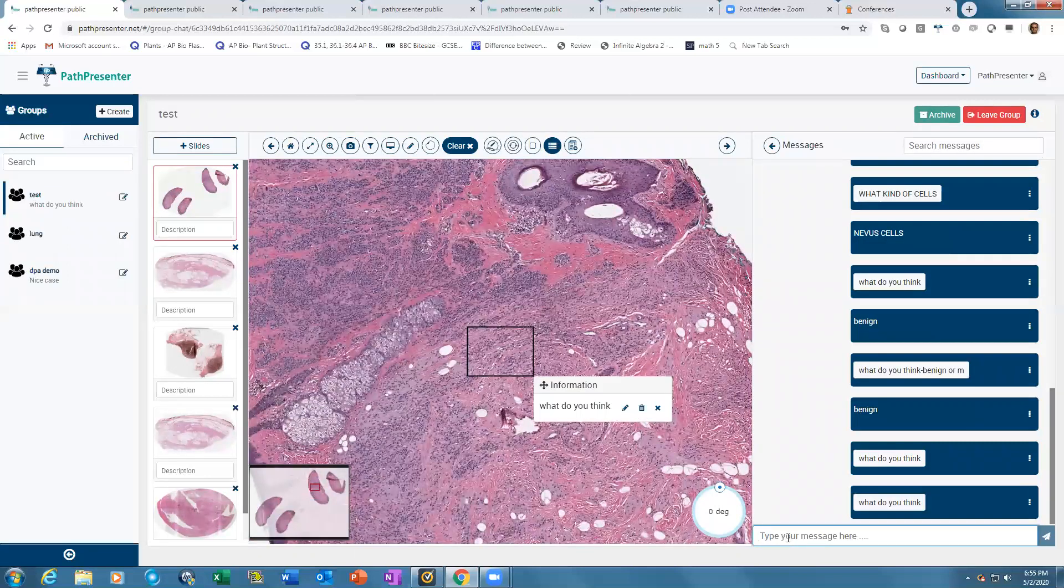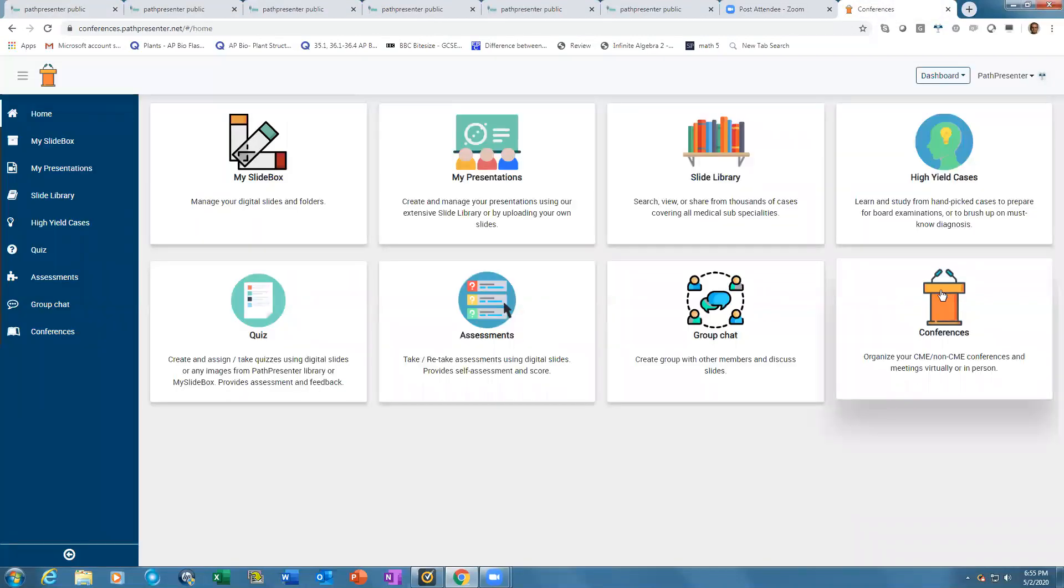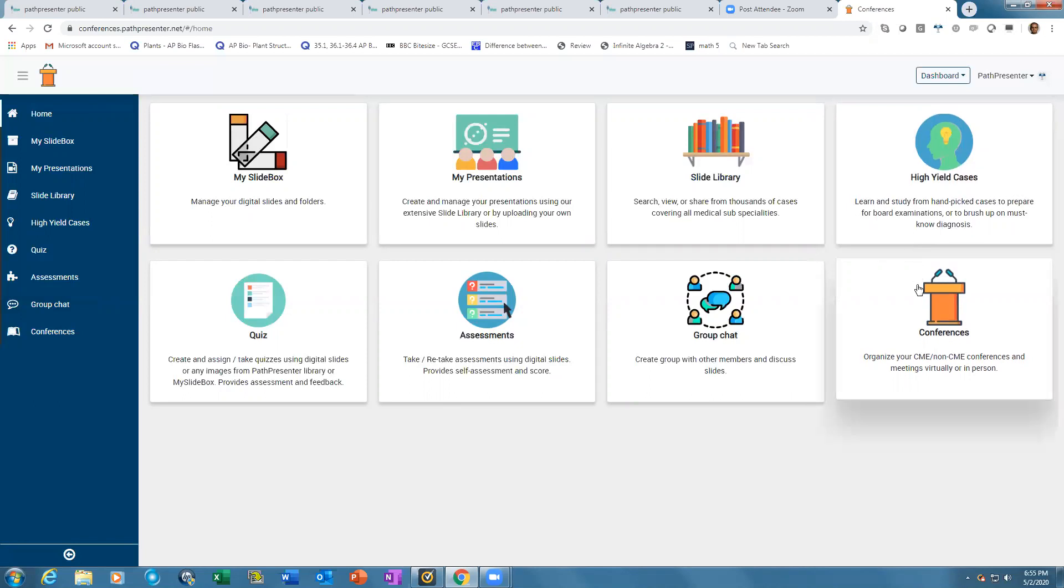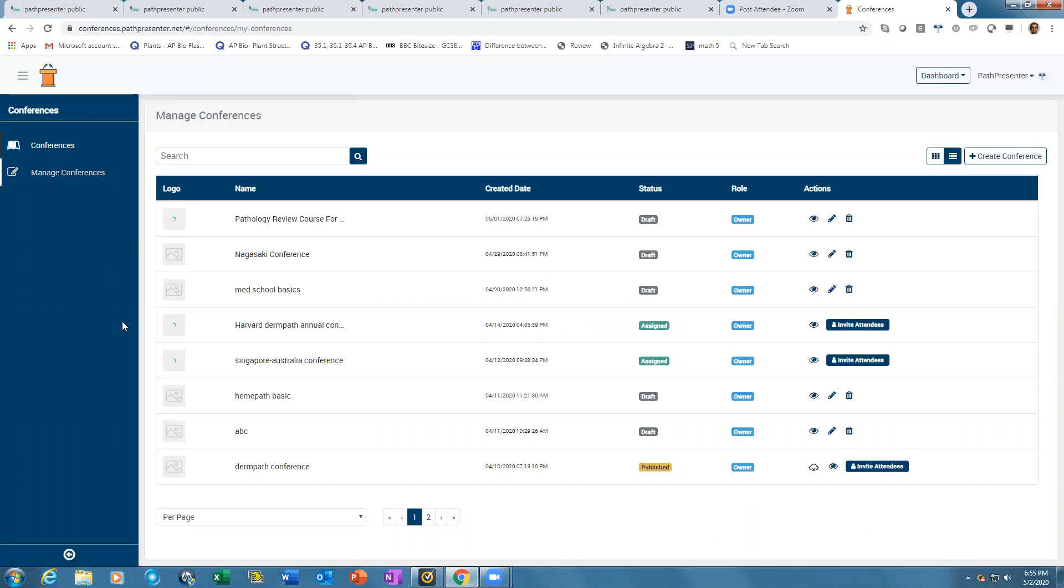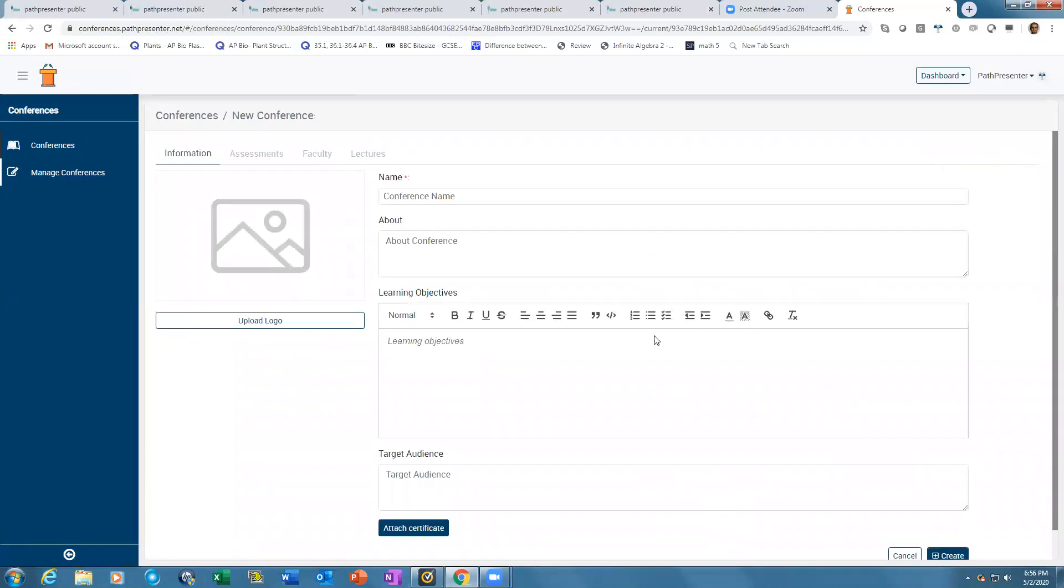The conference module allows you to create multi-institutional conferences where faculty can be invited from different organizations across the world to build and deliver lectures. Attendees can be provided with pre and post assessment quizzes, get CME certification, and virtually network with other attendees and faculty. It's easy to create a conference - add CME certification, assessments, invite faculty who create lectures, then once published, invite attendees to attend and download CME certification.